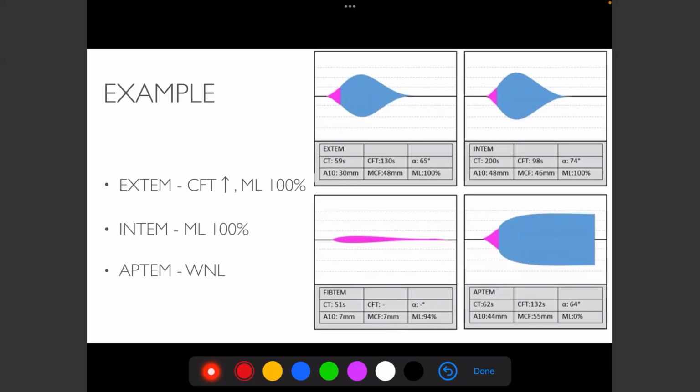All right, more examples. And to your point about speed, you're more than welcome to sit. Sometimes you have a clinical pretest probability. You can sit in the room and watch it read out. You don't have to wait for the printout. You can catch it right in the middle and then go to work. It's so fast. The trauma centers have it up, and the graph is live time. It's not like you need 60 minutes. When we'd run them for hearts, I'll just stand there, because you get your actionable data, your clotting time, your clot formation time in like 2 minutes. So you can just stand there, say, oh, those are normal, and then circle back to it.